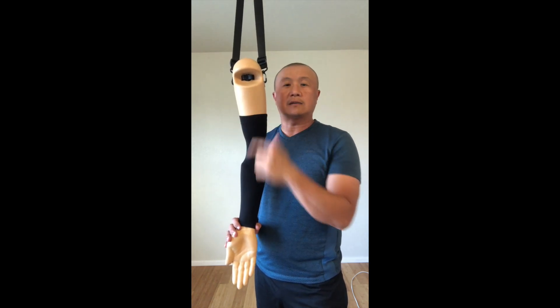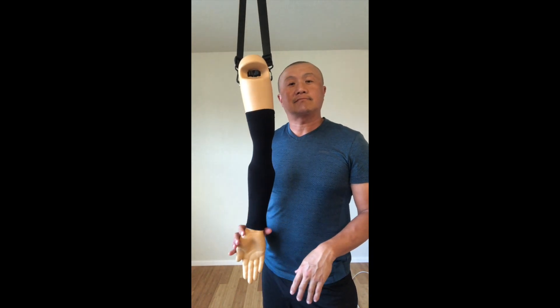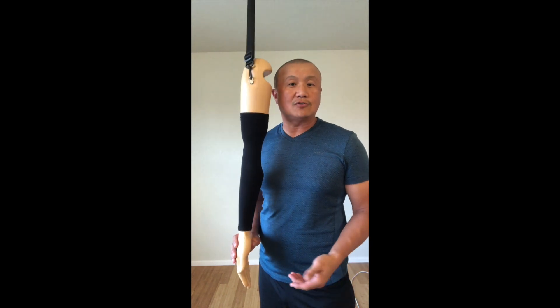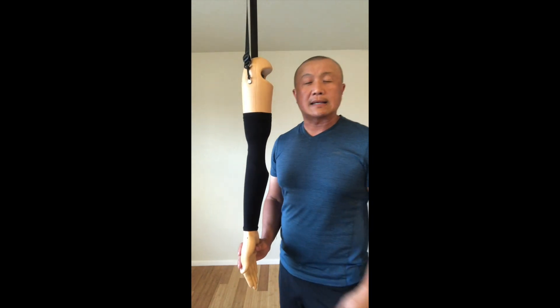They're going to have an elbow dislocation simulator and also a shoulder dislocation simulator. Today I'm trying to explain how you can use this in a classroom for an athletic training program, specifically for the clinical skill class.